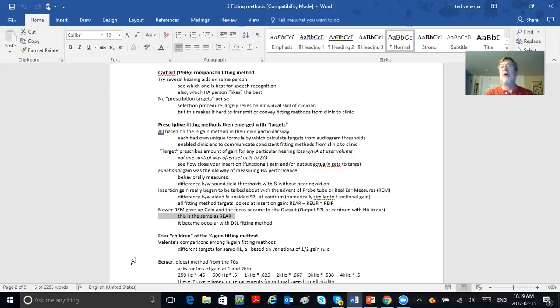The computer automatically changes those thresholds into thresholds in dB SPL. And then, with those thresholds, you map aided speech on it and see if aided speech is visually situated properly, above the guy's thresholds and below the guy's UCLs.